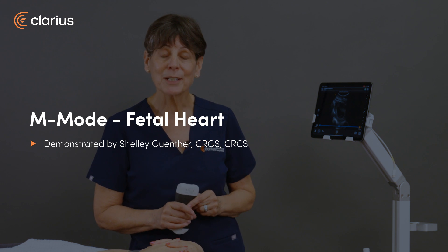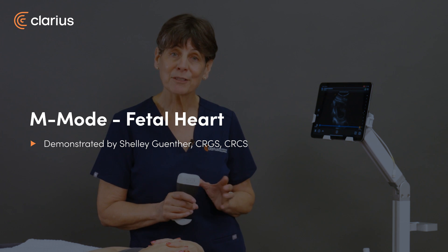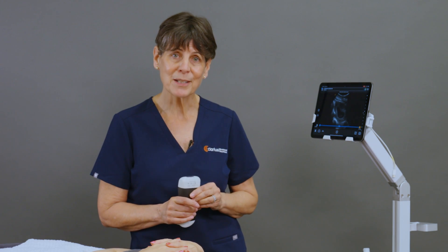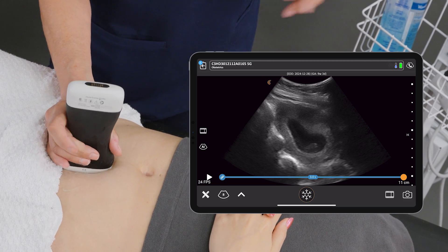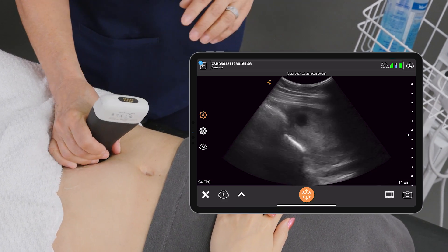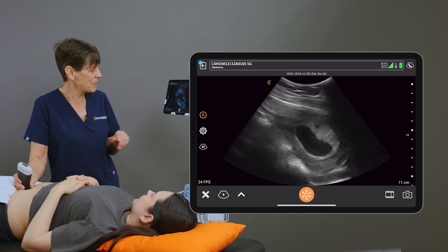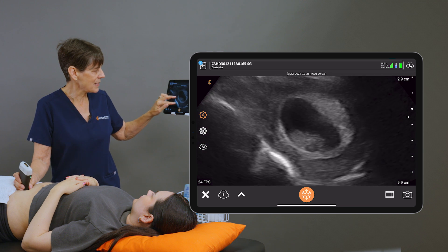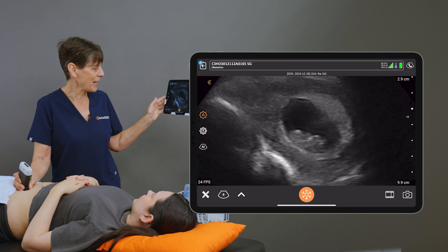Hi, my name is Shelley and today we're going to show you how to locate the fetal heart and do an M-mode measurement to establish the heart rate. We're going to place our scanner over our little baby here and I'm going to zoom the image, which makes it easier to see. Right there we can see some fetal heart activity.